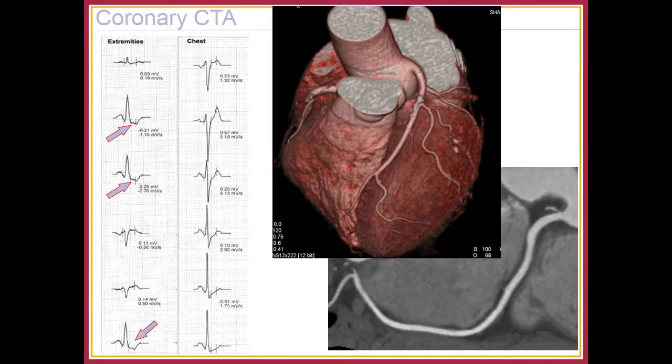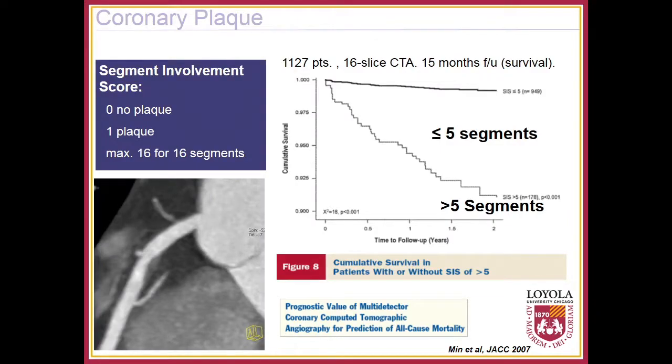Now I'd like to switch gears and talk about some of the prognostication of coronary CTA. This was one of the earlier studies published in JACC in 2007 using 16-slice CTA.